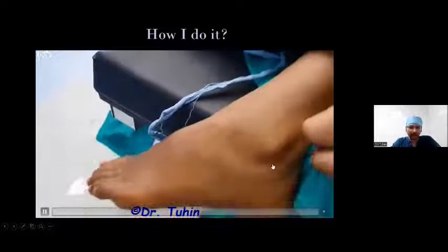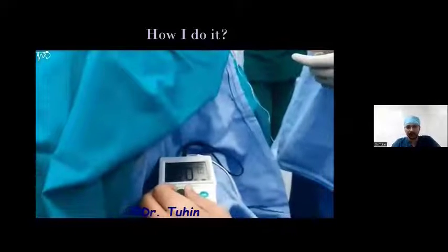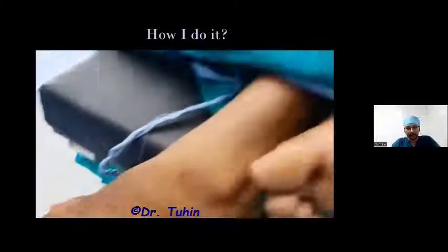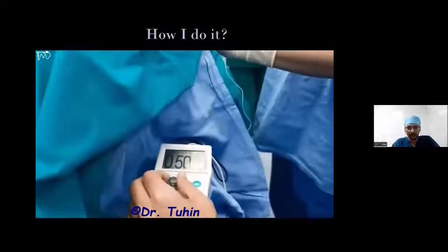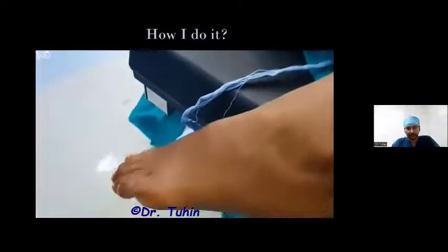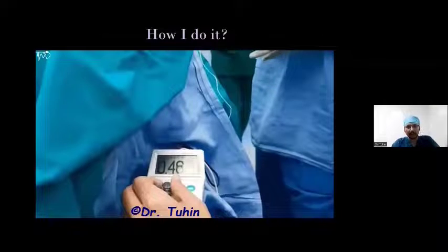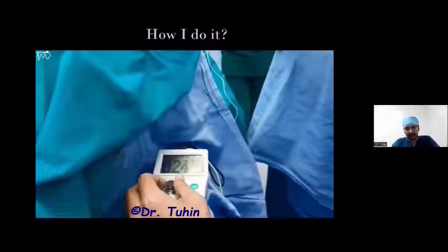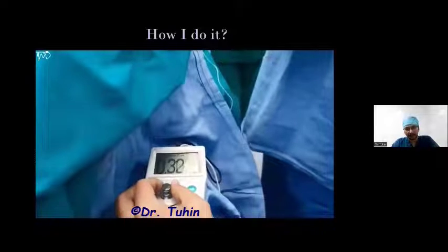So it is a very simple landmark and very simple approach if you follow the basic guidelines. Initially you saw that my extension line was open to the air. I usually keep that because there are a lot of vessels there: pudendal vessels, inferior gluteal vessels, superior gluteal vessels. So if you connect the local anesthetic syringe and flush it with the syringe, your backflow of the small veins may not come out.